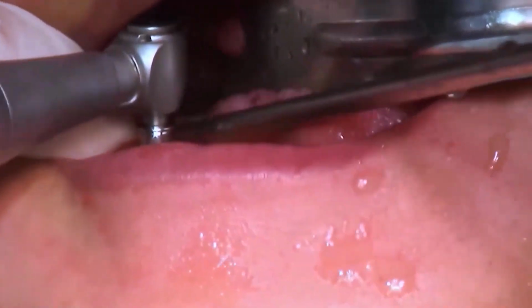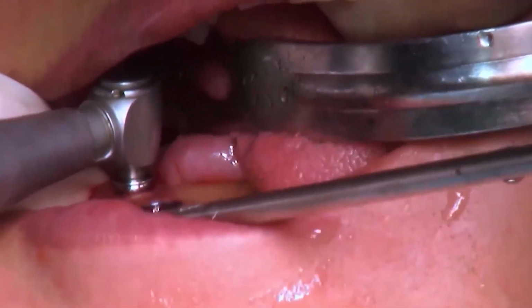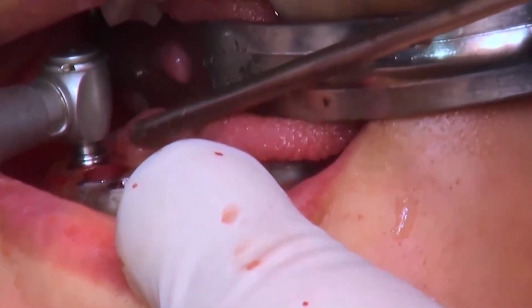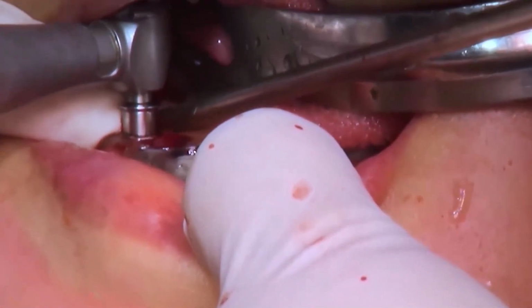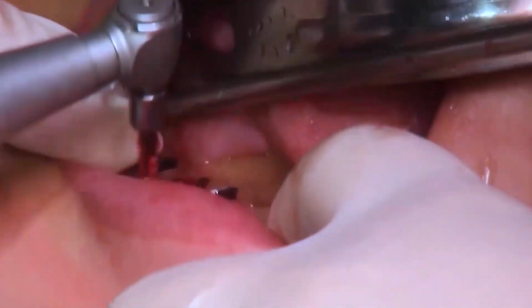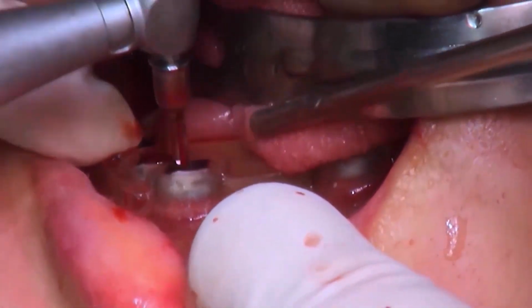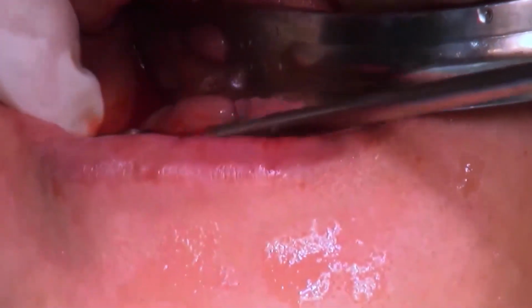The drilling is at low speed, with 100 RPM. Now we are increasing the diameter of the drill and the length of the drills.